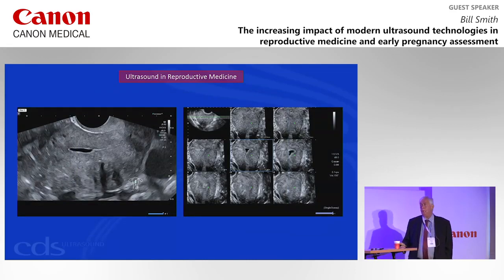Here's a patient who's gone through several cycles of estrogen treatments, part of an ovum donation program. And this is, I think, earlier this year.